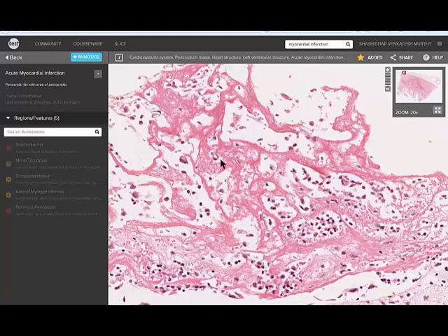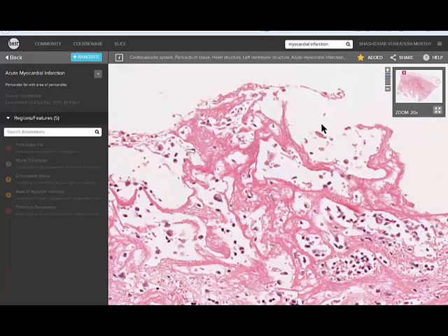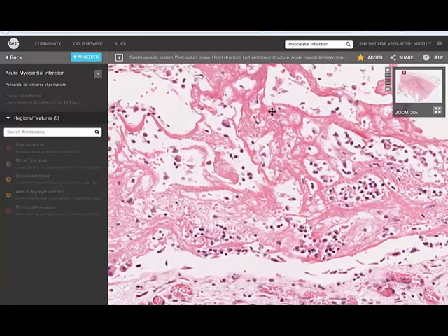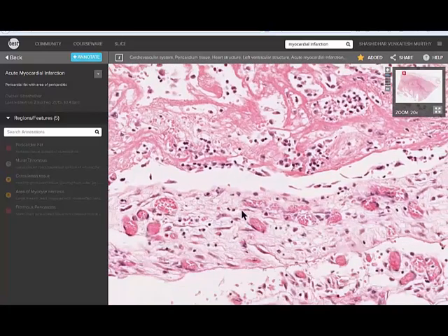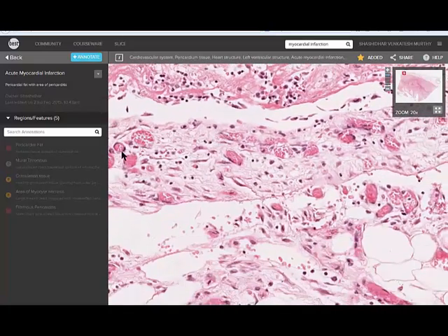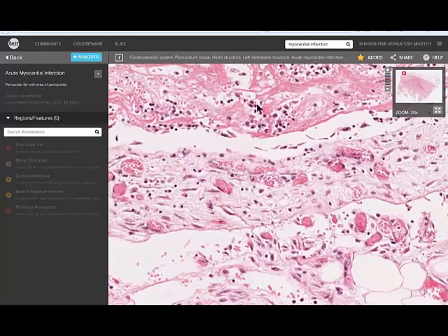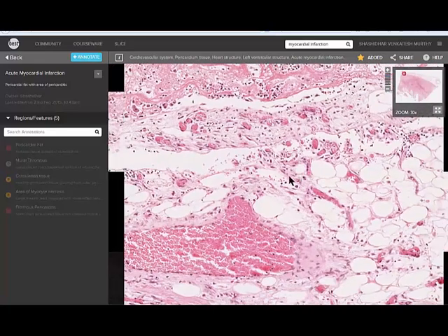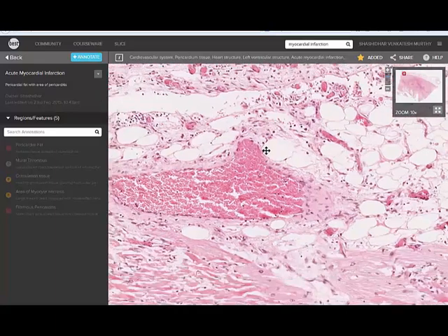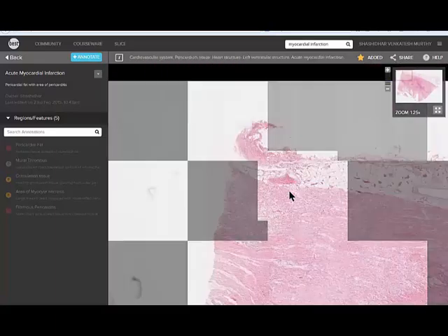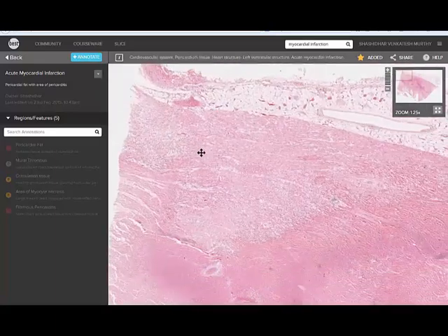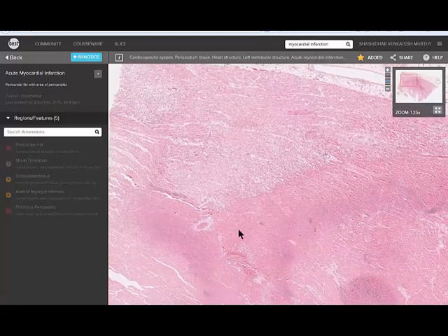It would be a whitish clot depending on the amount of RBC. It can be whitish to reddish. This deposition on the surface of the pericardium is what is termed fibrinous pericarditis, that is the fibrin, inflammatory cells. Plenty of dilated capillaries, that is the origin of the protein coming out from here. Gradually we go down, that's the congested blood vessel. I will start from the area of the dead tissue.